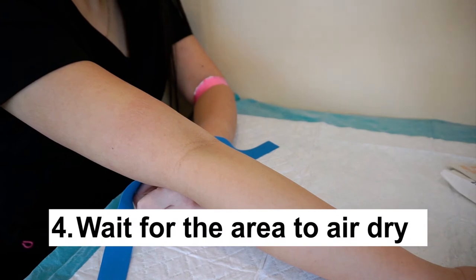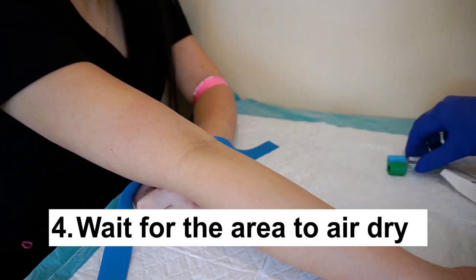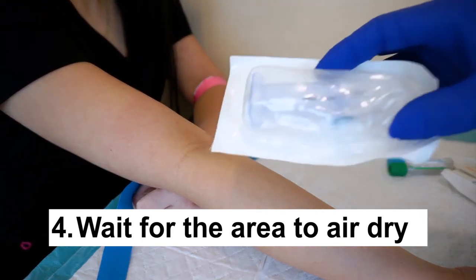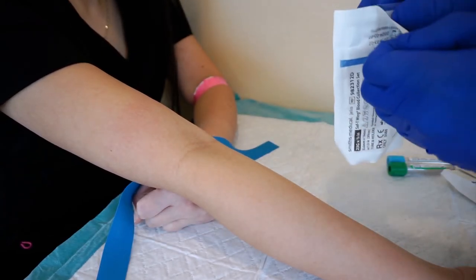Fourth, wait for the area to dry before puncturing the vein. Do not blow nor wave because you will reintroduce bacteria to the drawing site. During the wait, you can prepare the gauze, bandage, and blood collection tubes in the correct order of draw.